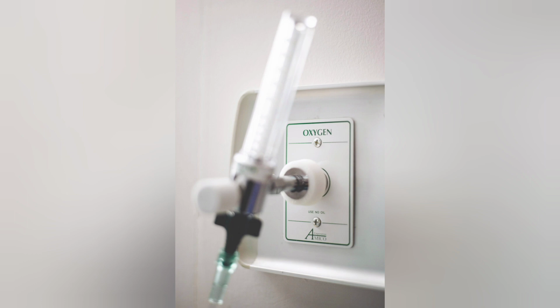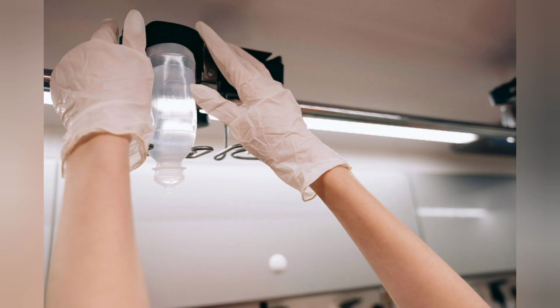Equipment setup. Select the appropriate oxygen delivery device based on the patient's condition and prescribed therapy. Connect the oxygen tubing to the oxygen source securely. Adjust the flow rate of oxygen according to the prescribed amount.